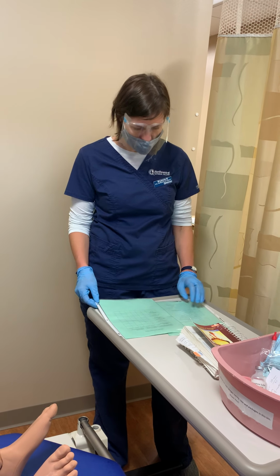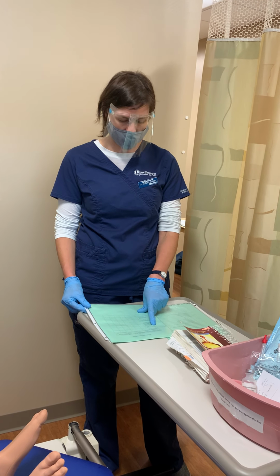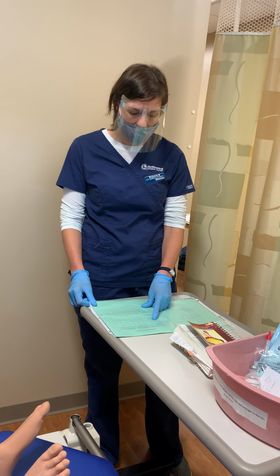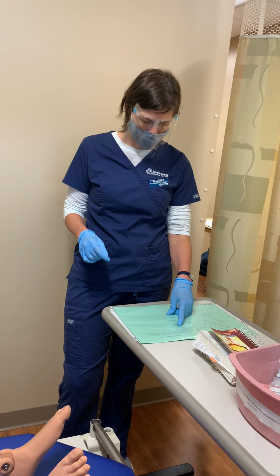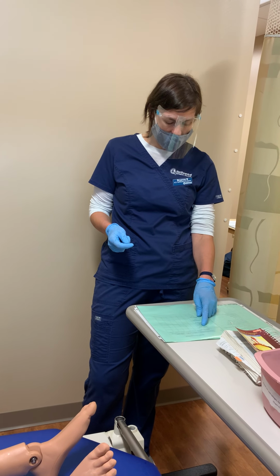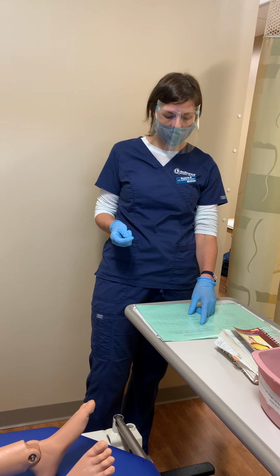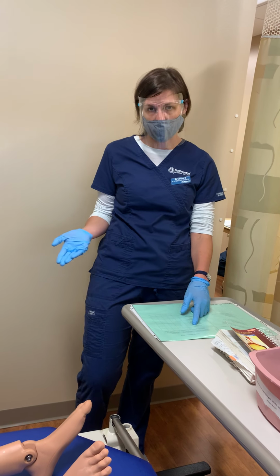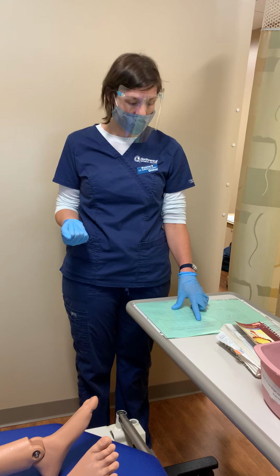I also know that looking at my potassium, which is what I'm going to administer first, doctor's order is 10 milliequivalents in 100 ml IV piggyback. I do have exactly that in a bag, and looking at the book, I see that 10 milliequivalents per hour is the recommended rate. So I'll do 100 ml per hour, which will be the 10 milliequivalents for my rate for my piggyback.